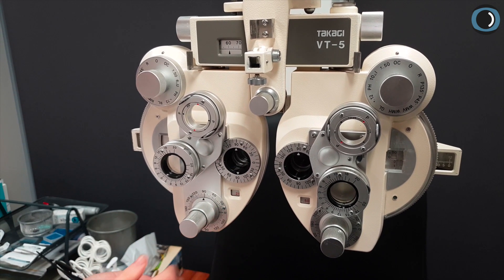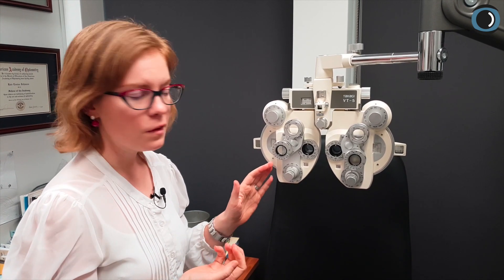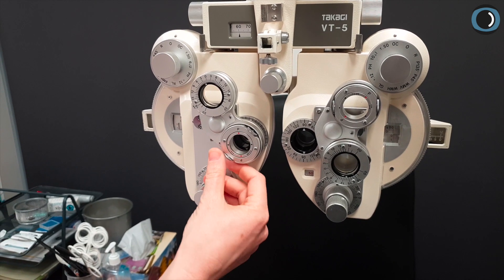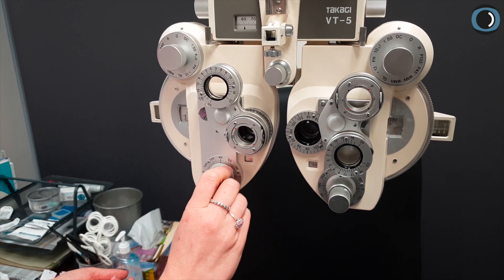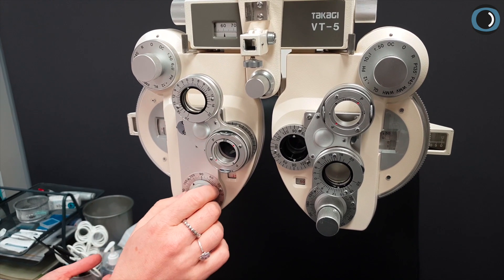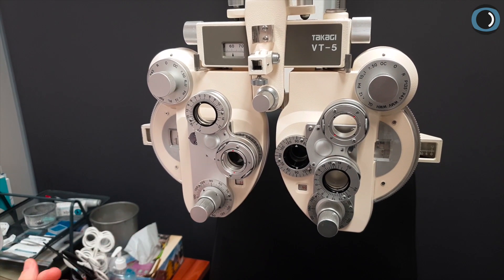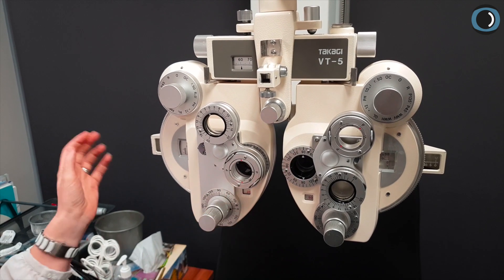The last thing I want to show you is what to do if someone has a low cylinder or if you're not sure they have any cylinder at all — let's go fishing for cylinder. Say we've done our retinoscopy or their previous refraction doesn't have much cylinder. Give them a 025 cylinder and check: do they actually want a 025 cylinder? Do they want any more power — red — or no power — black? Check at 90, 45, 180, and 135. If you do this in these four meridians and each time they prefer black, then they don't have any cylinder. If you went to try and measure a cylinder axis, you'd waste their time and the patient would struggle to give you answers. So go fishing for cylinder, and if they prefer black along these four meridians, your job's done — there's no cylinder.